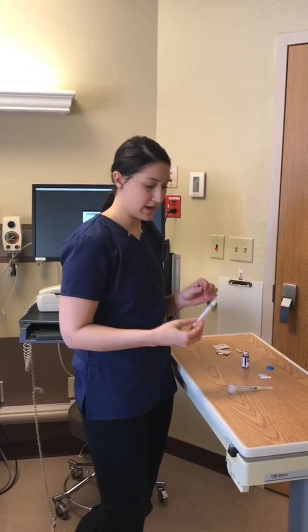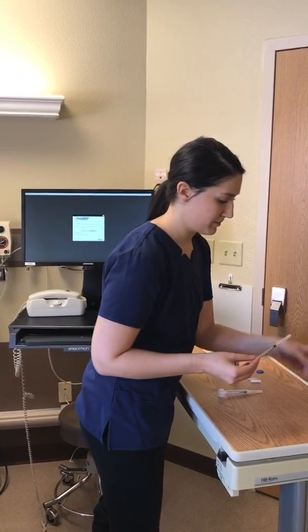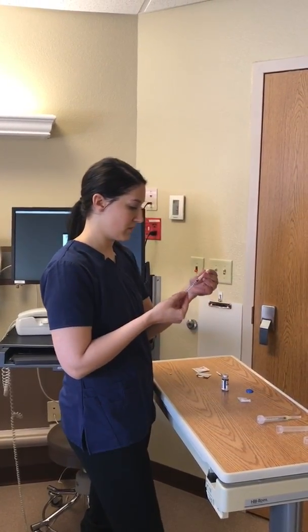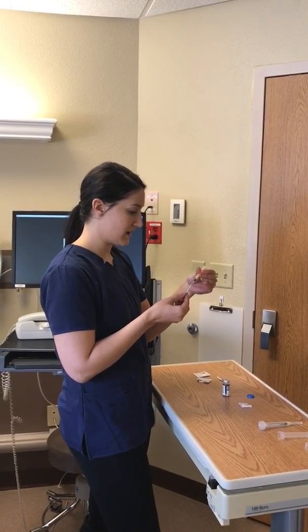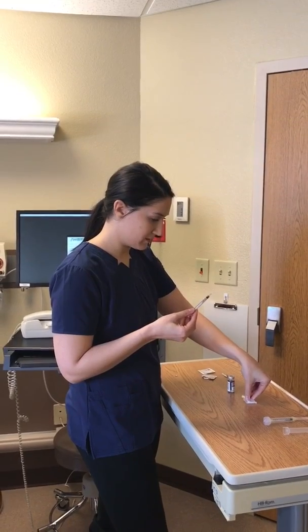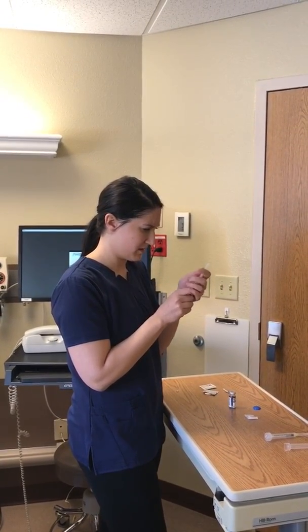I'm going to take my needle out. And I'm going to go ahead and uncap my needle. Put that on my sterile surface. I'm going to uncap my needle.